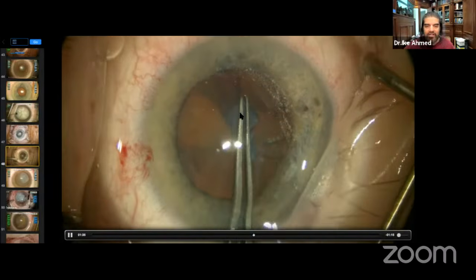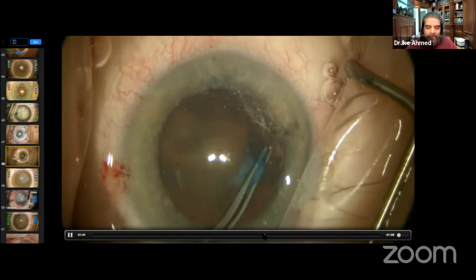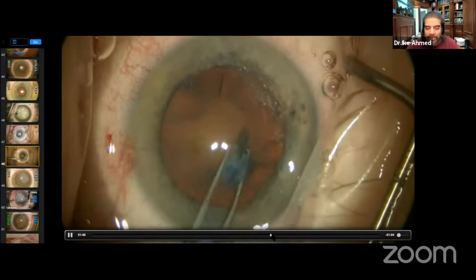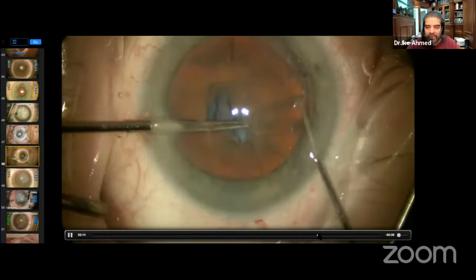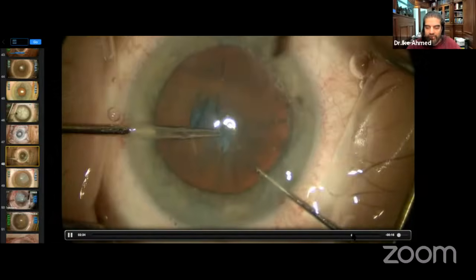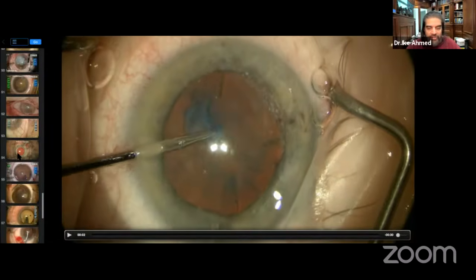And you see there's certain areas where I can do a continuous tear. It's nice to do a continuous tear in some areas because it may allow the lens to be better positioned, even though the capsulotomy will be irregular. And so the use of micro scissors is helpful. At the end, we will use another cut here along the temporal side to allow us to make this one continuous rexis. So it's just something to consider when we manage these cases that are challenging.